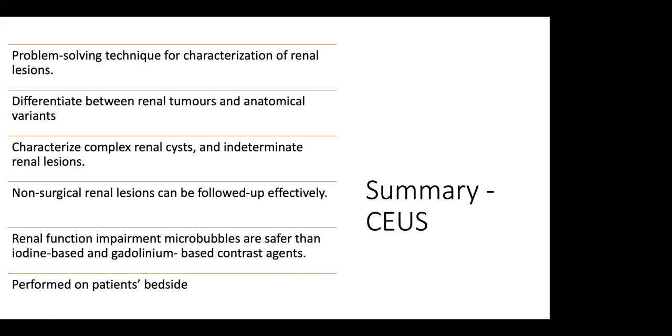If we are not able to see any indeterminate features, then we don't need to move further for evaluation. But if there are some indeterminate things, like the density is in the indeterminate range, there is a questionable nodule, then we have to further characterize that lesion.